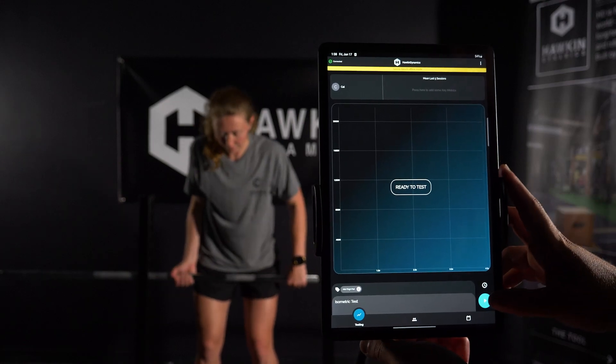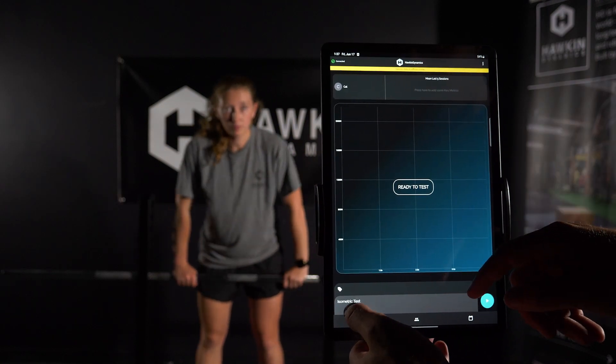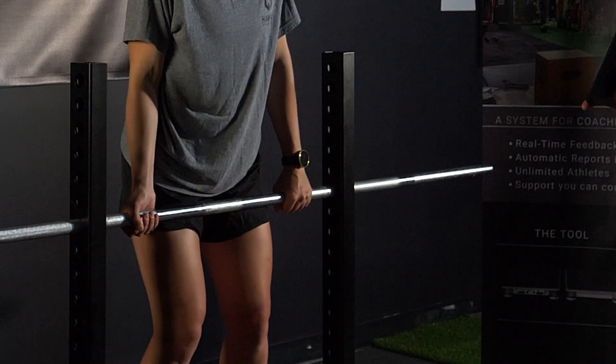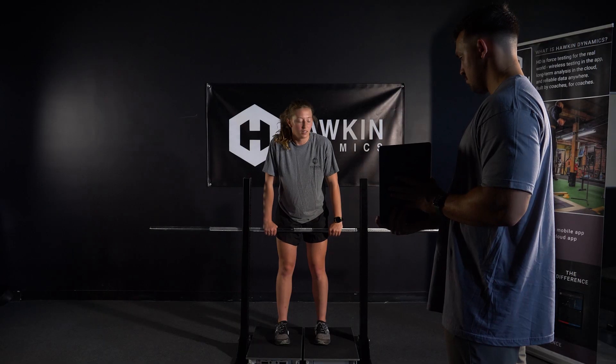Instruct the athlete to firmly grab the bar. Grip positions may vary based on testing logistics and time constraints. Overhand is preferable if the athlete has adequate grip strength. If grip strength is a limiting factor, a mixed grip is preferred. Belt straps or tape can also be used to tightly secure the hands.